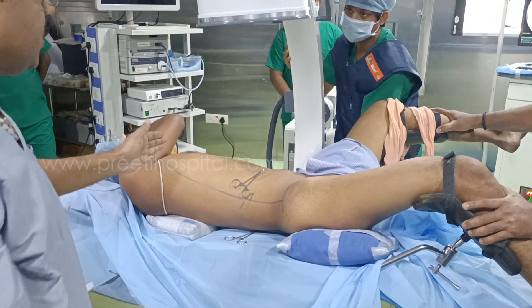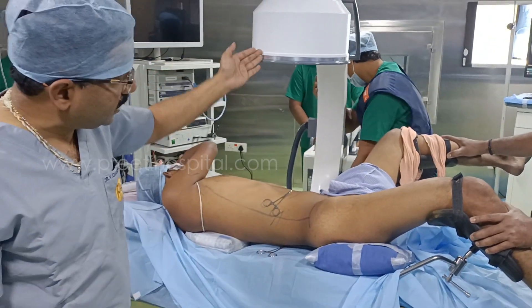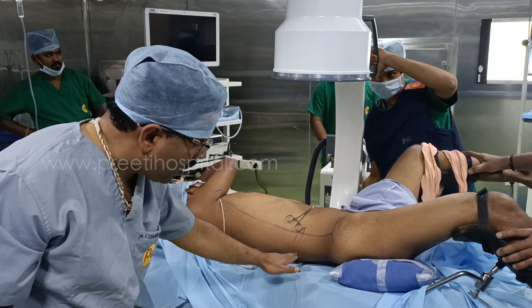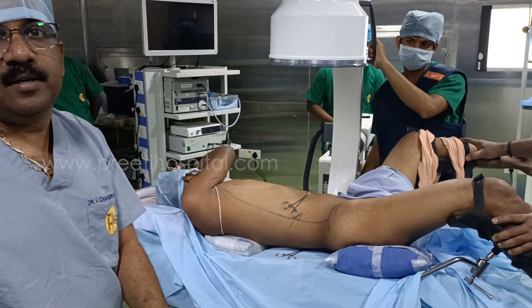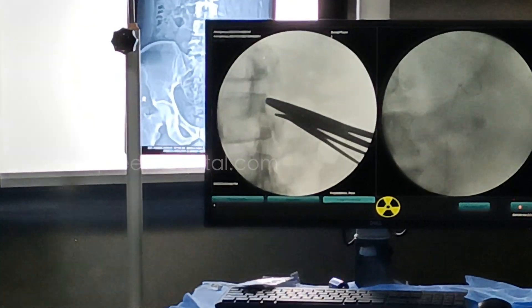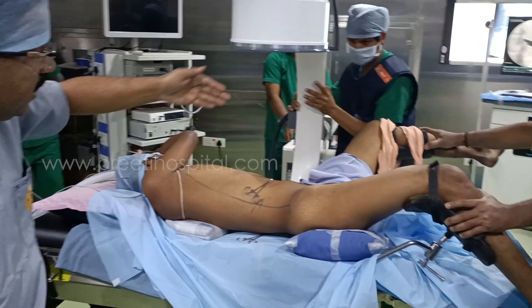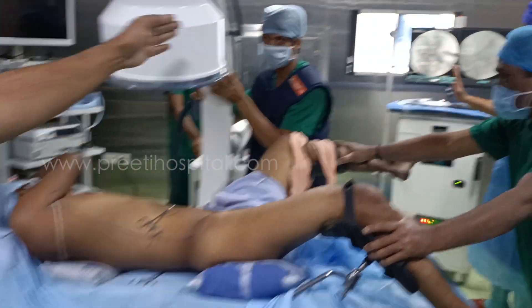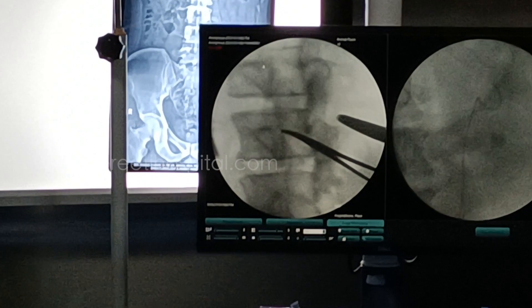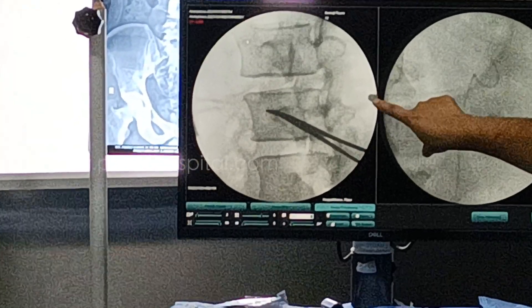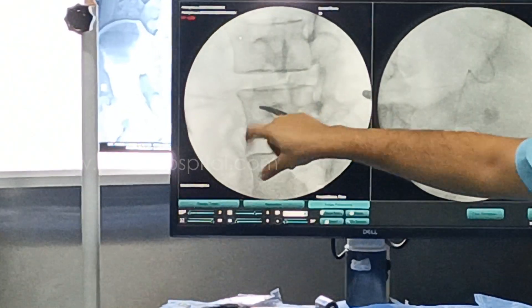Now come back. If you turn the SIAM 30 degrees towards the surgeon, the more posterior parts will go away from the spine. Now at 0 degrees they are at the same level. Now turning 30 degrees towards me — the heavy one has gone away from the spine — whereas this one has stayed back at the same point.